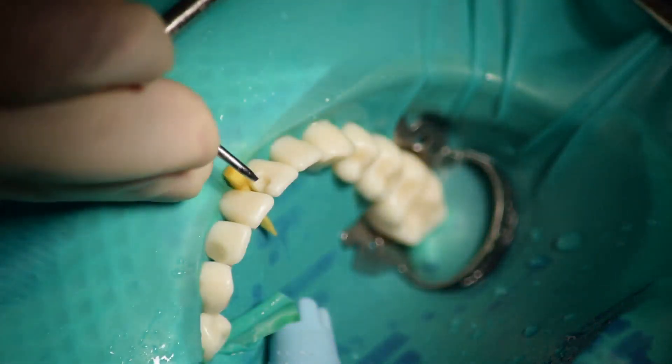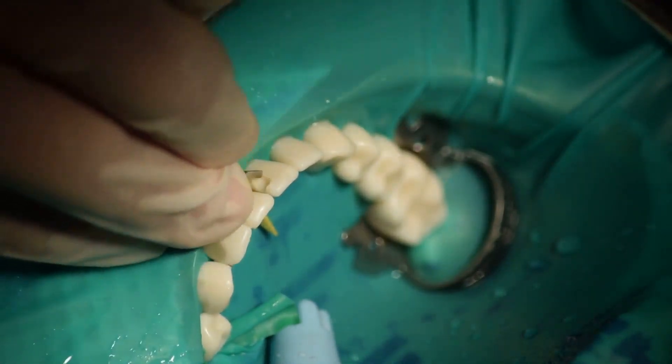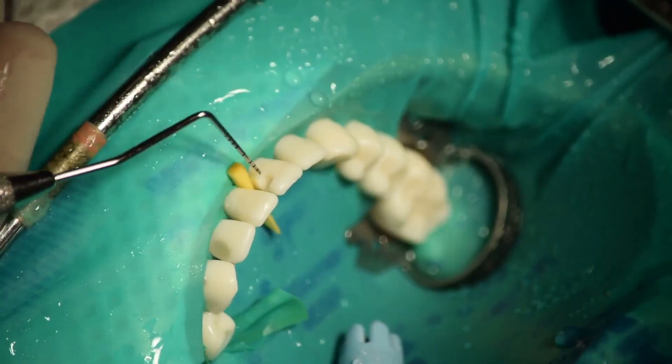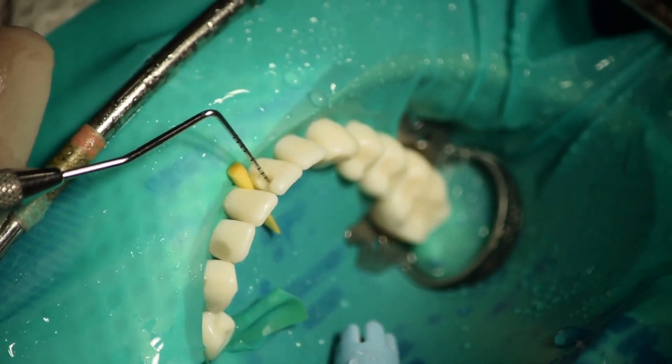You can ensure the smoothness of enamel by the aid of hand-cutting instruments such as the gingival marginal trimmer and hatchet. The last step of cavity preparation is checking the measurements and making sure that the cavity is smooth and even.